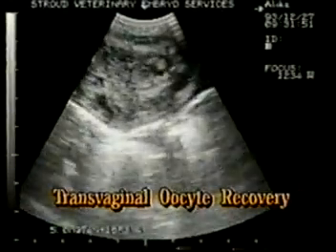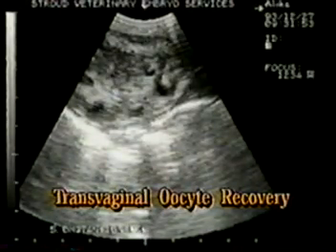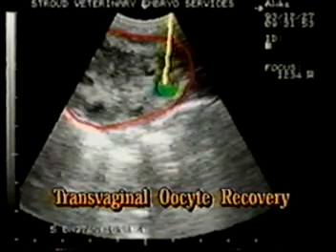A 50 centimeter long 18-gauge needle is inserted through the vaginal wall into the follicle of the ovary. A yellow line is superimposed over the needle itself. The ovary is encircled by the red line. Green represents the follicle that the tip of the needle is in.